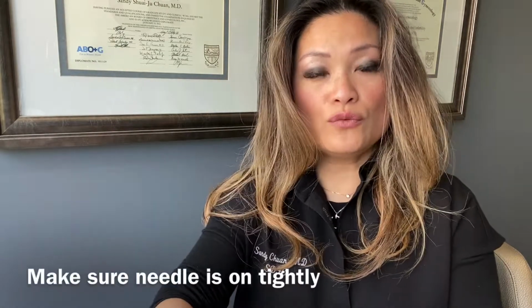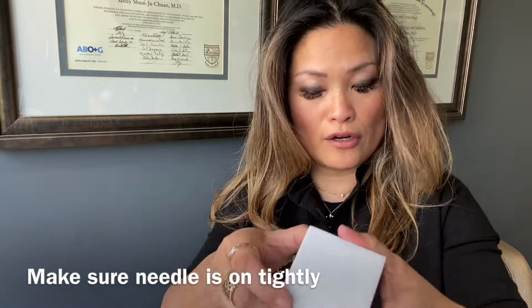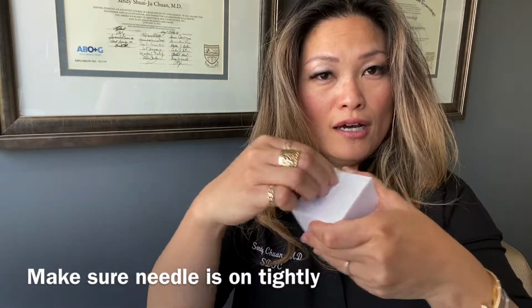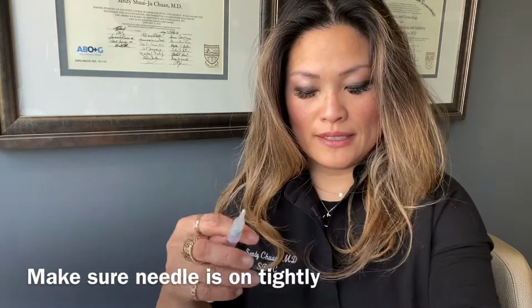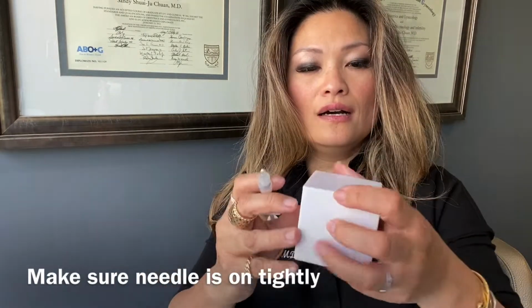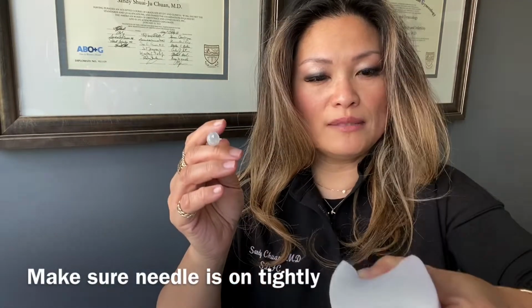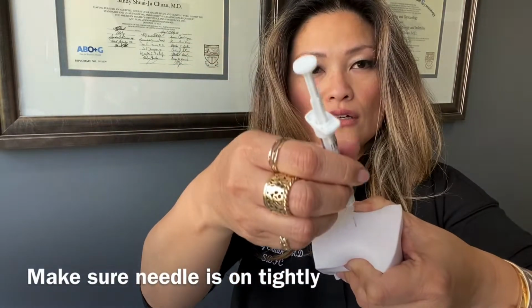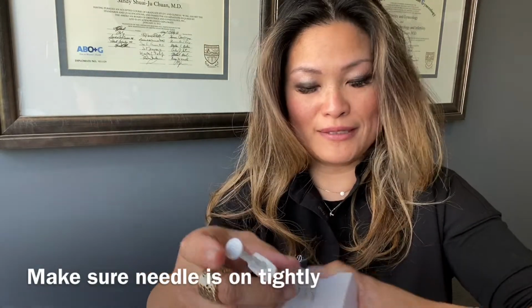Prepare your injection site by cleaning and wiping, and then get your needle ready. Pull back the skin and keep it taut, but squeeze the flesh, and then go all the way in and inject, okay? And then you're done with the Cetrotide.